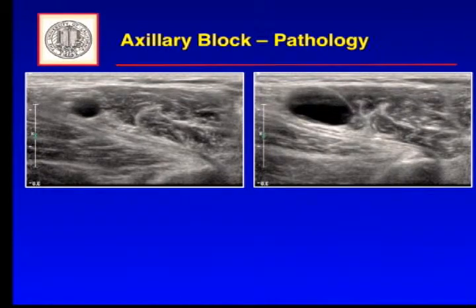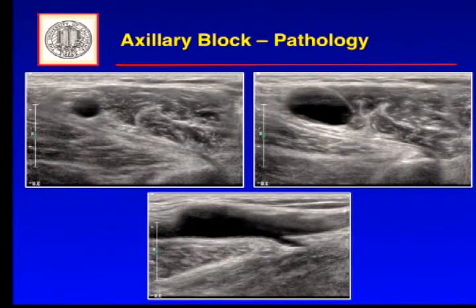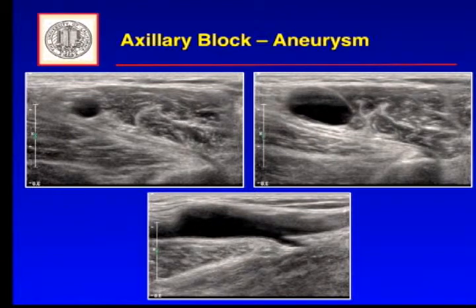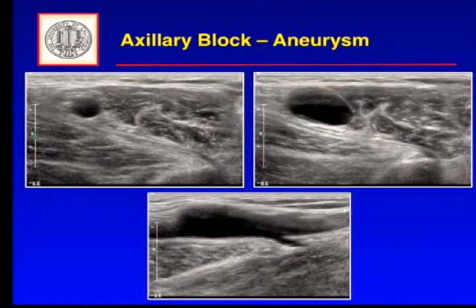Looking at multiple short-axis and long-axis views with Doppler — that's an aneurysm of the axillary artery. This was actually an incidental finding. Although we had done a complete history and physical, this man eventually admitted he had sustained a gunshot wound to his axilla, and after we scanned it he had aneurysm formation there. On further examination we found a fairly well-hidden bullet entrance wound on the back of his arm. We did do the axillary block, but chose to go in a region where the artery was not aneurysmal. Ultrasound gives us a lot of choices — we're not going to go where the aneurysm is forming.